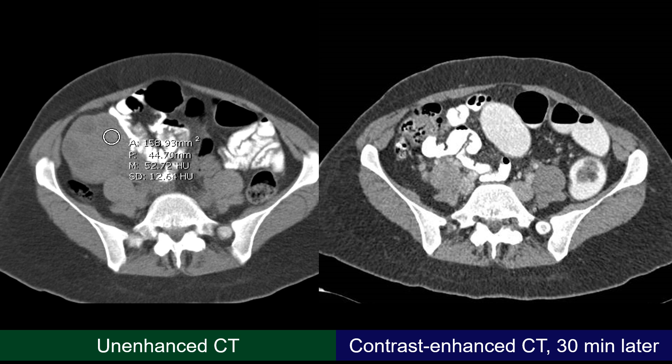For iron, fresh blood is a possibility but here we are not dealing with that — this is clearly a solid lesion. Good examples of a solid lesion containing iron include splenosis, and a good example of a solid lesion containing iodine is struma ovarii, just to mention one example of each.